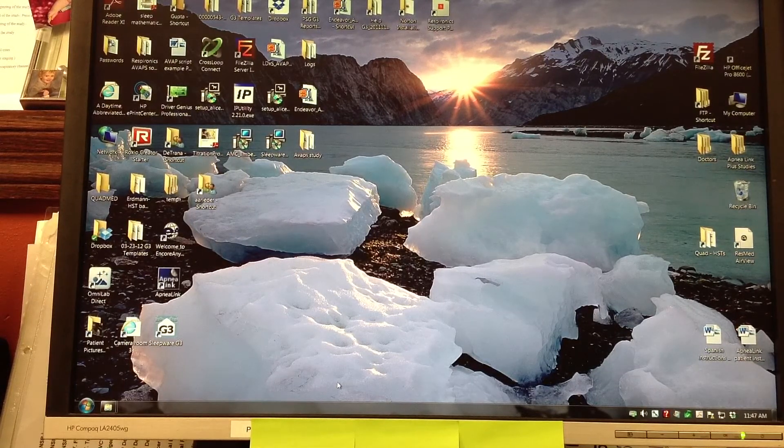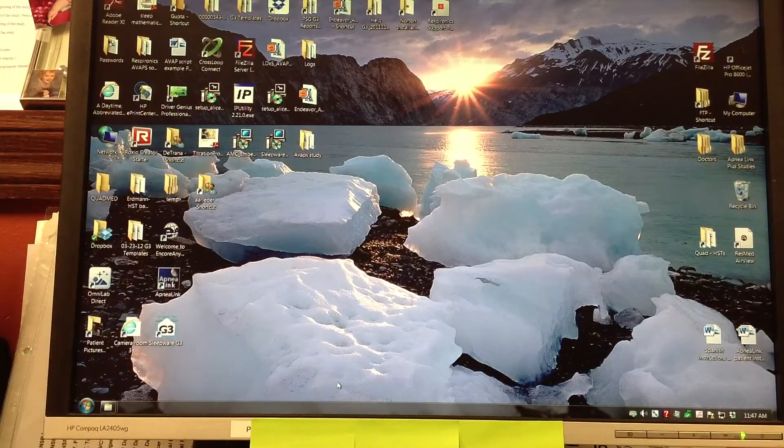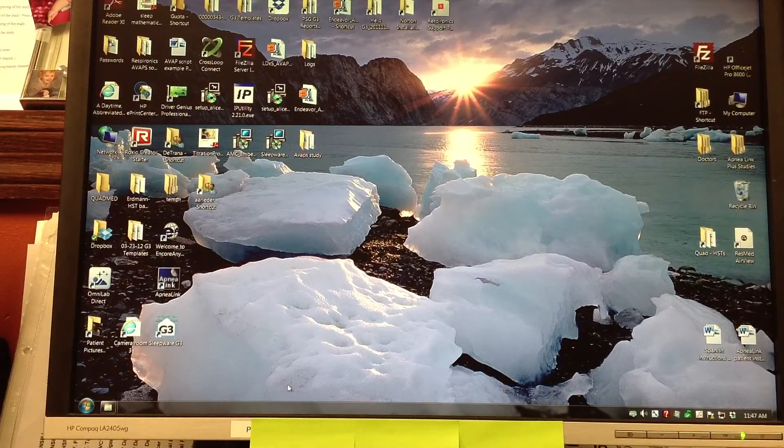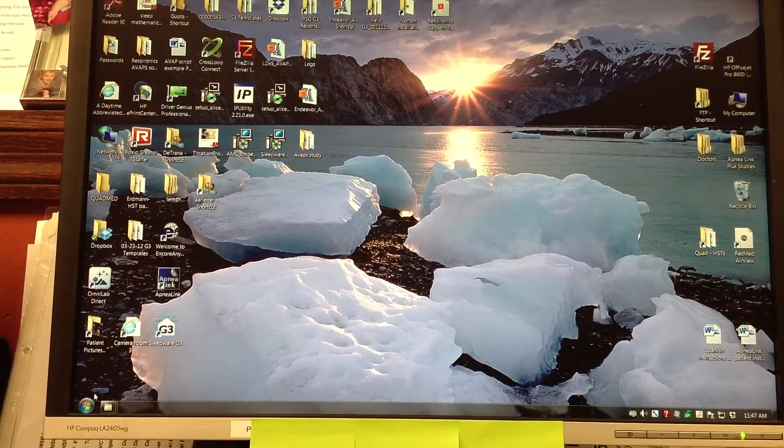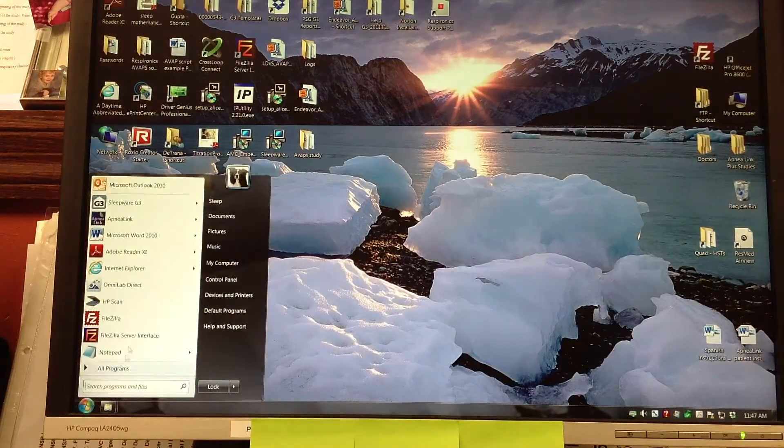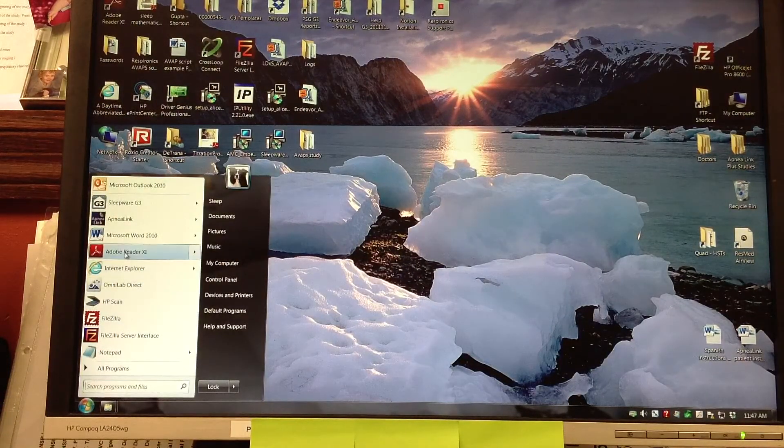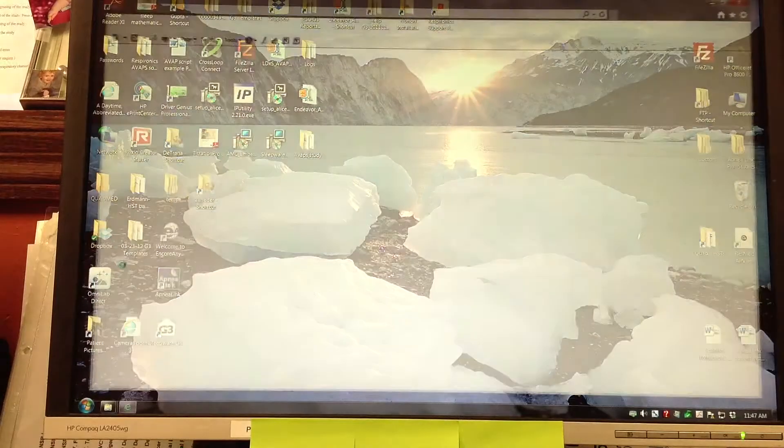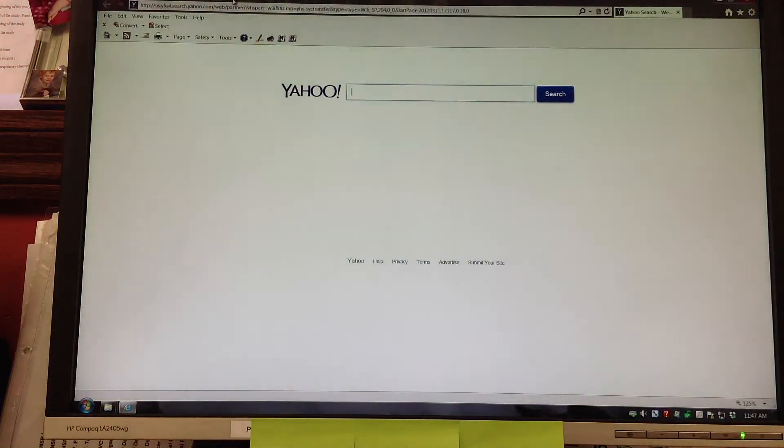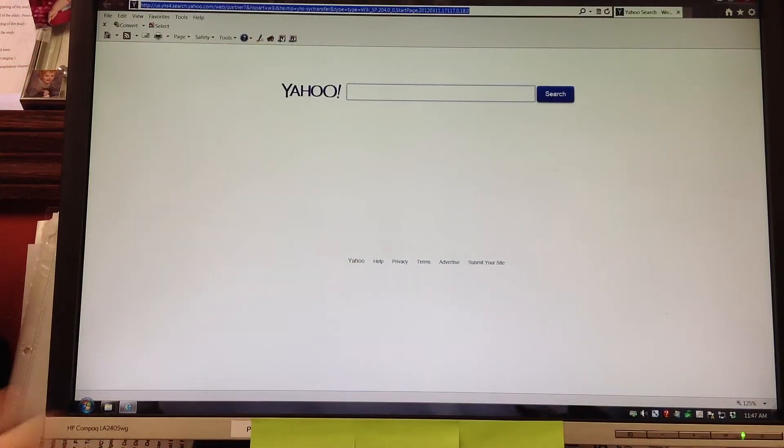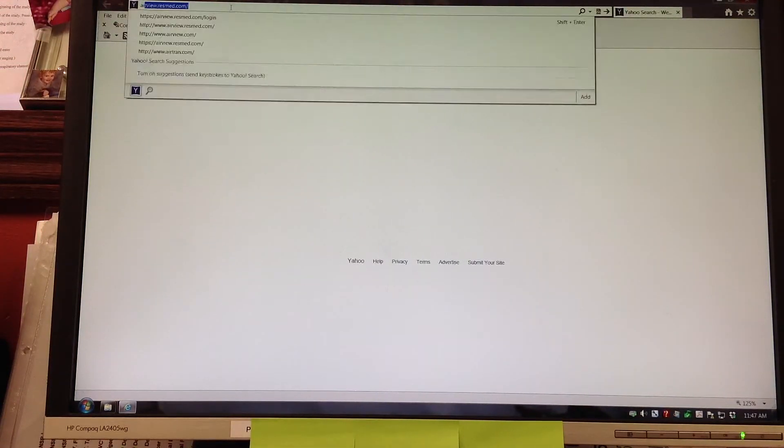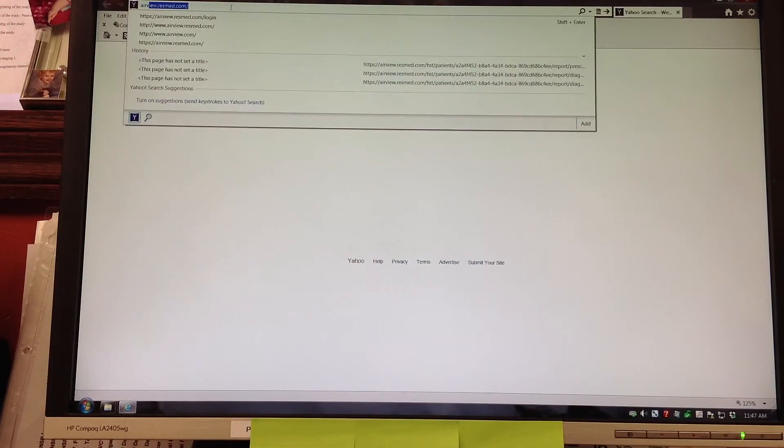Teresa is going to start by going to Internet Explorer and typing in airview.resmed.com. Again, this is something that you could save to your favorites and have an icon on your desktop.